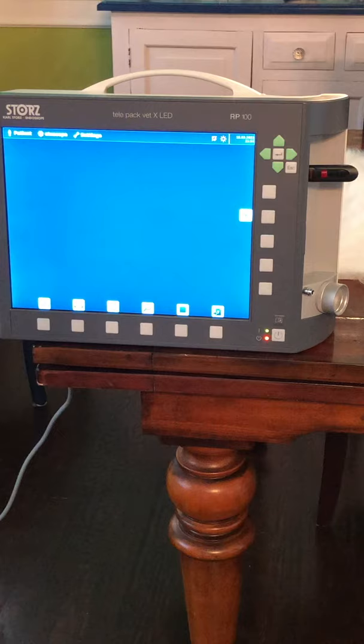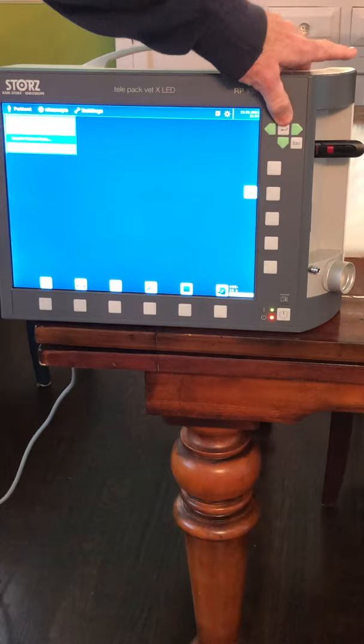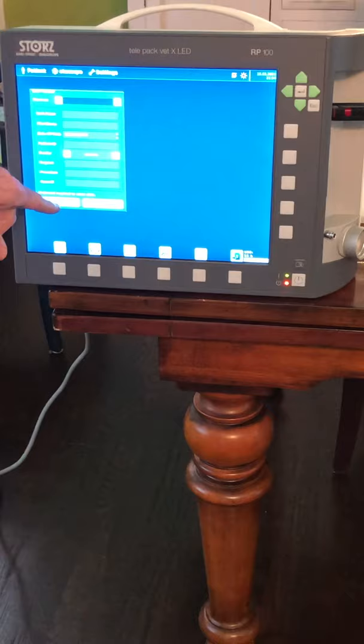Once you see that the flash drive is connected, press the right green arrow and go to New Patient. Once you hit enter, a screen comes up and with a keyboard you can plug in all the patient information. I don't have the keyboard connected, so I'm just going to click OK.